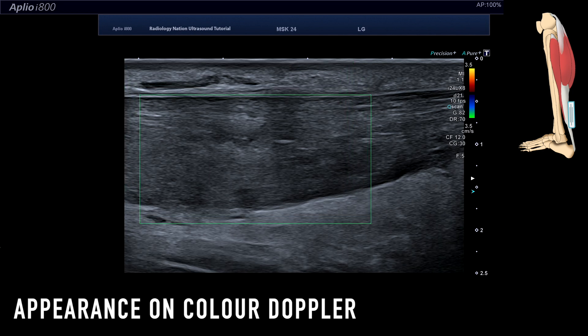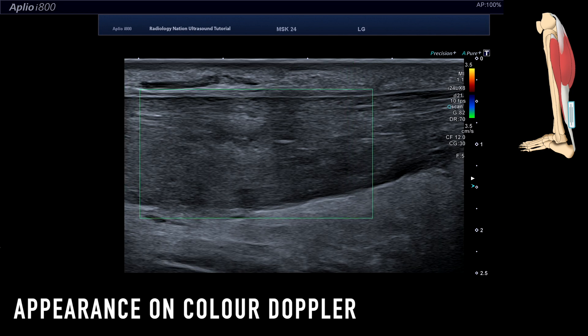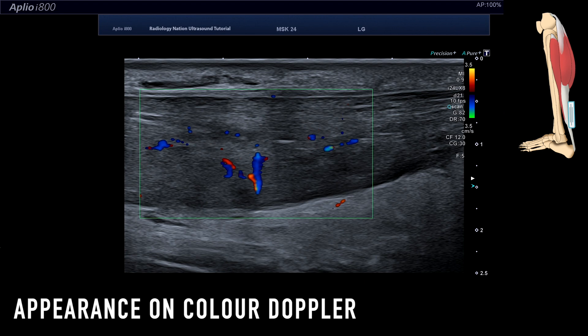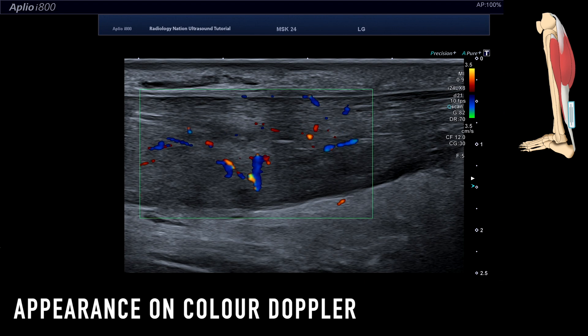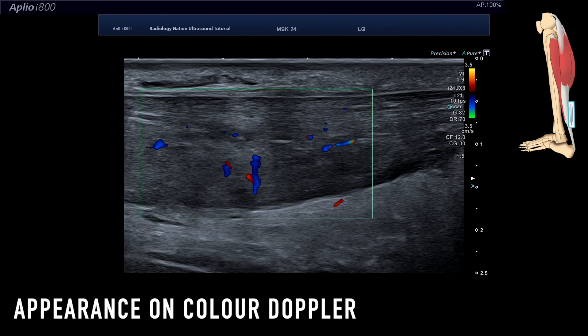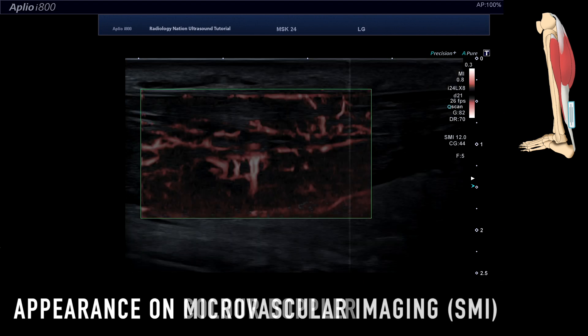Note the difference in sensitivity between Colour Doppler and microvascular imaging, as neovascularisation is more clearly demonstrated when SMI is enabled.